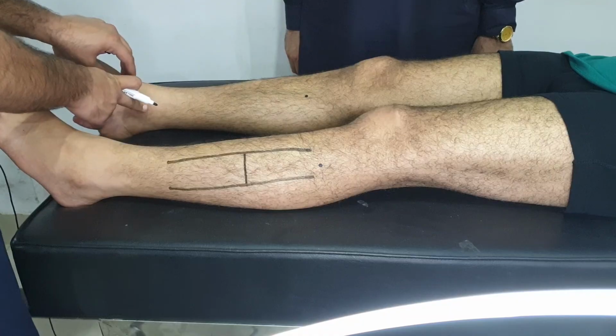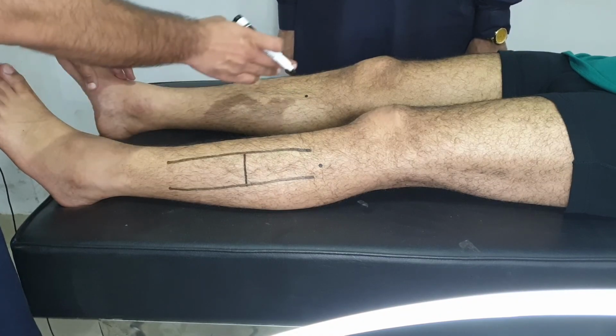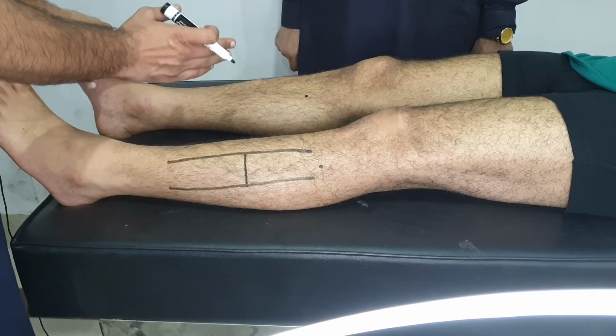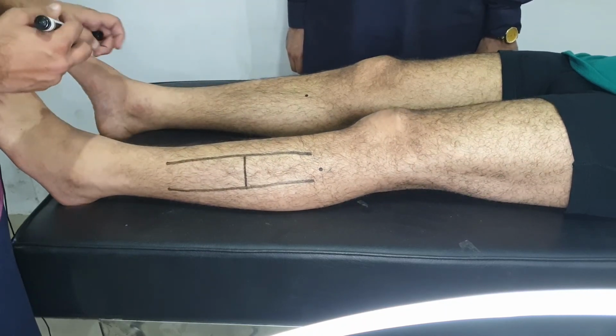And sir, inferiorly the medial malleolus is our landmark. When we incise the skin, we reach the deep fascia, we incise the deep fascia and we cause the decompression of superficial and deep posterior compartments.